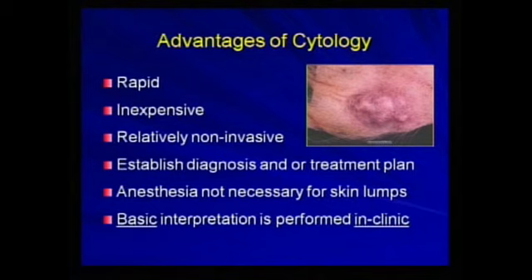They do help establish a diagnosis or treatment plan. This is very much the same as a surgical biopsy. It's not meant to determine a definitive diagnosis, but certainly you can render the information necessary for a clinician to decide whether he wants to take this patient to surgery or not. For most skin tumors, anesthesia is not necessary.